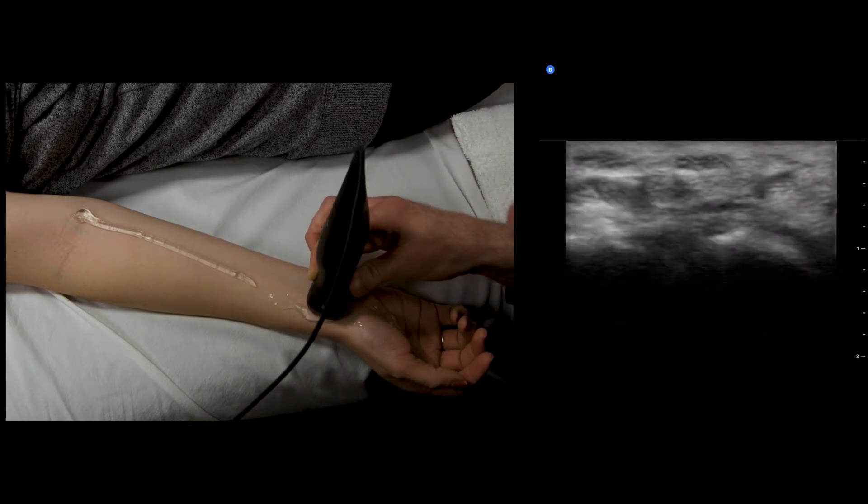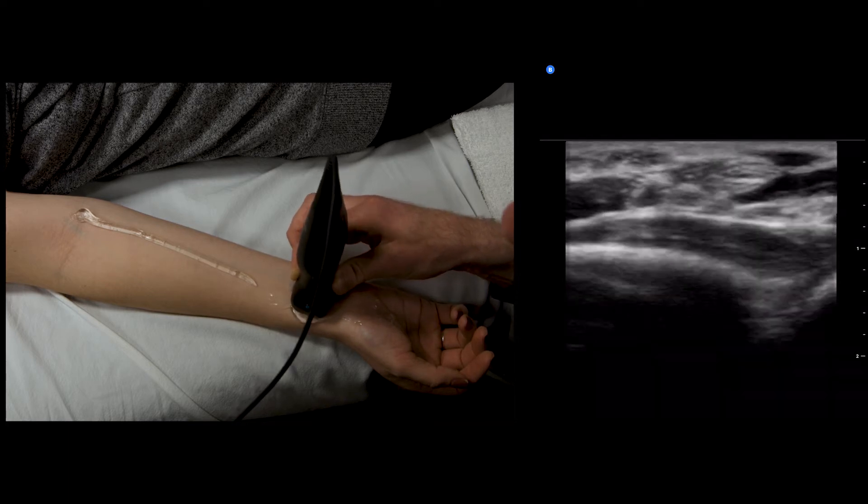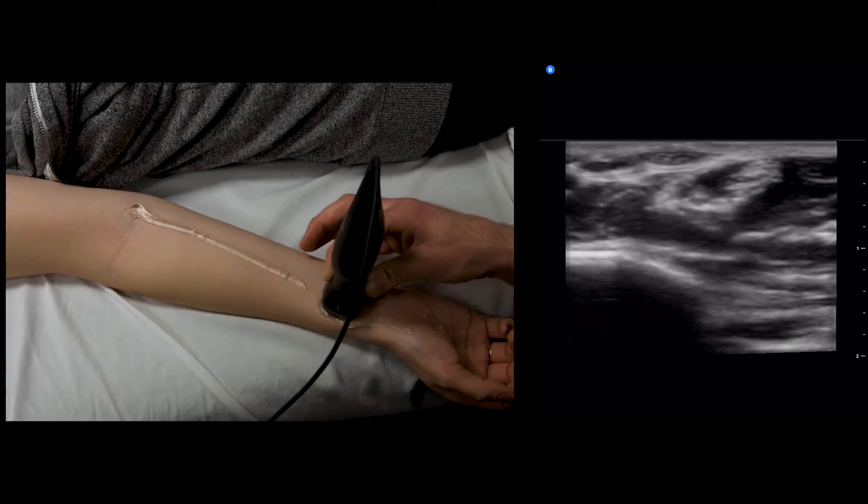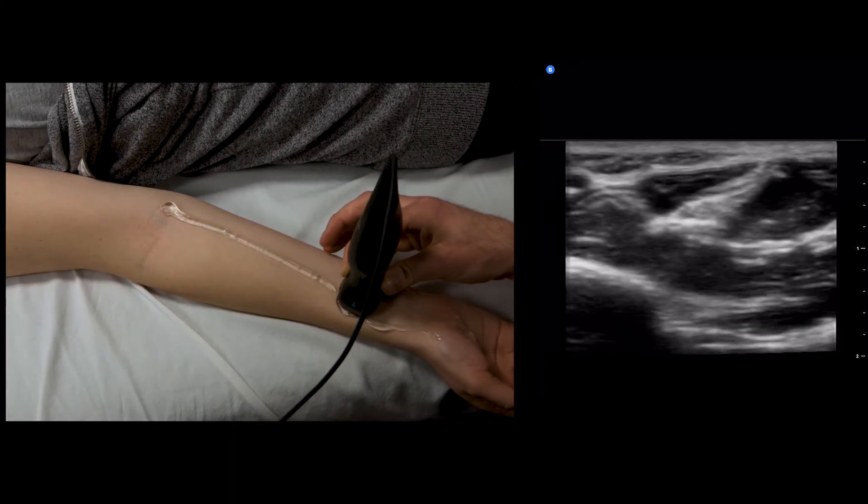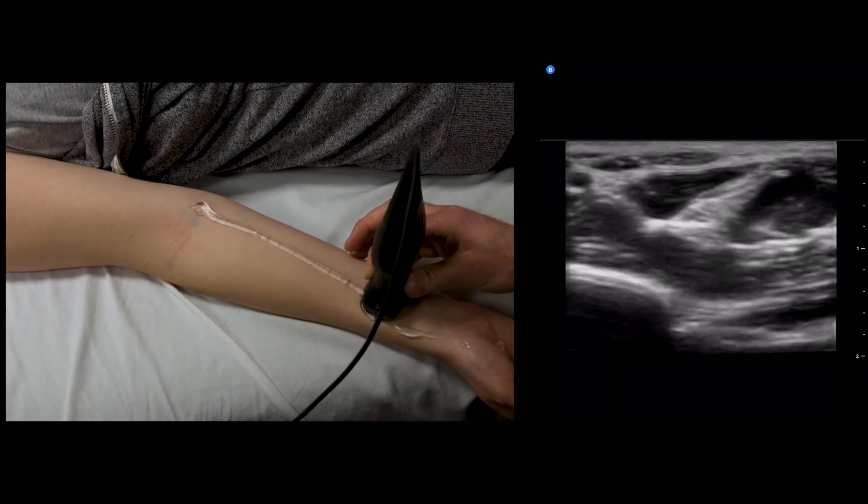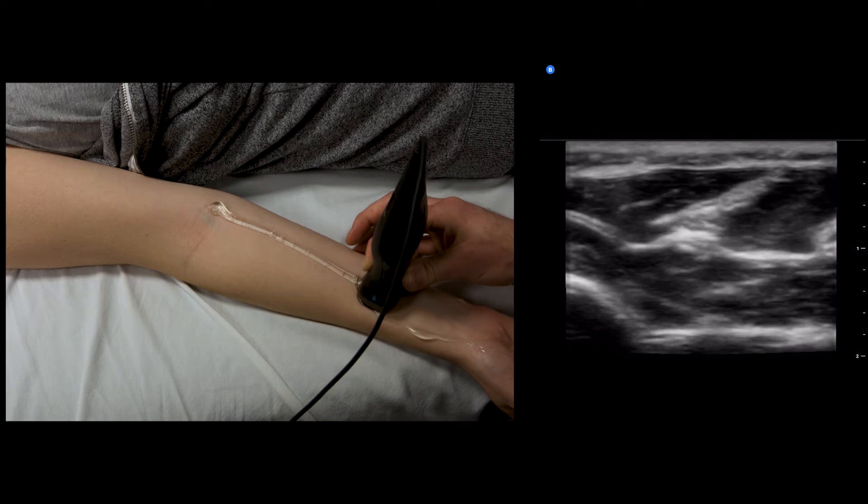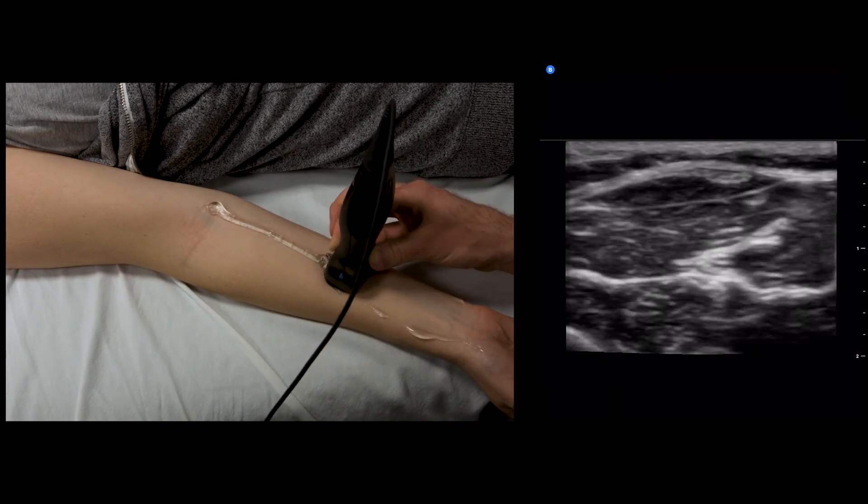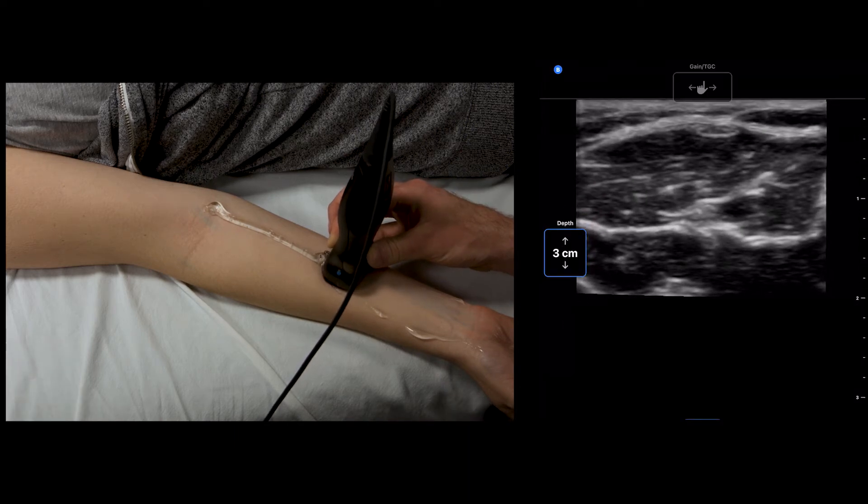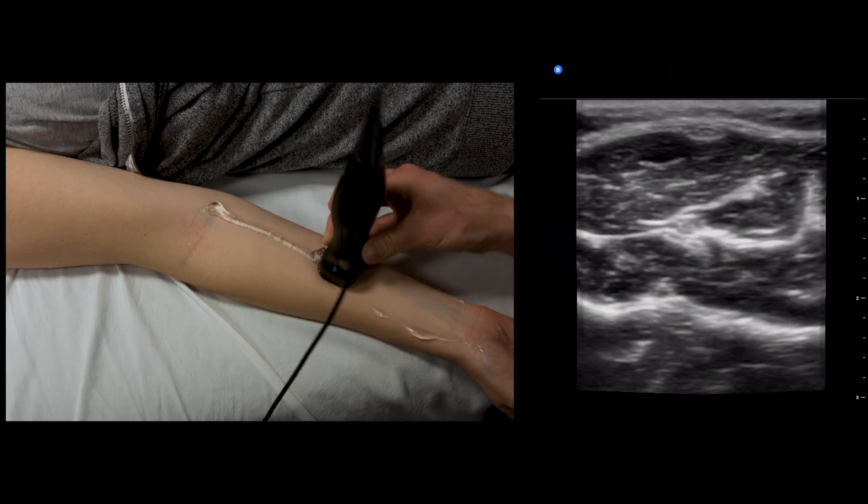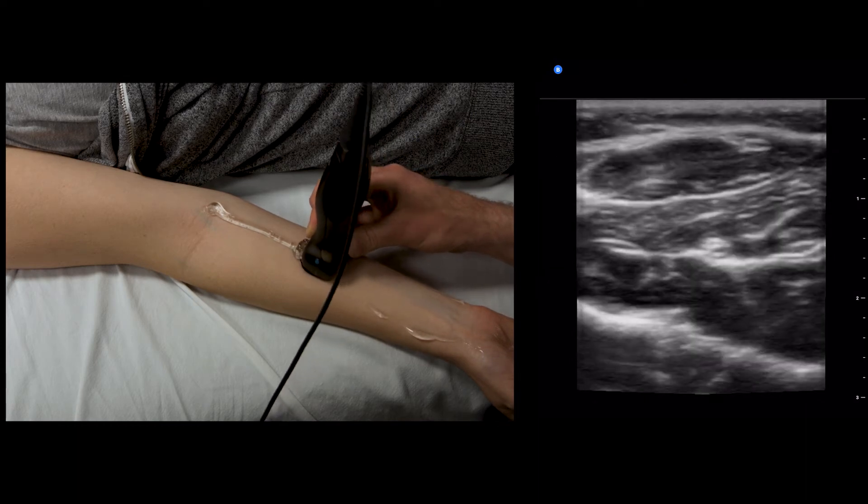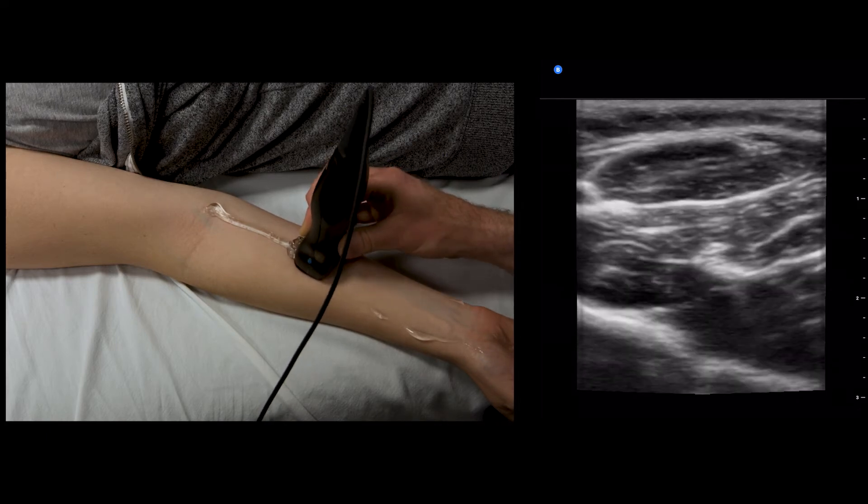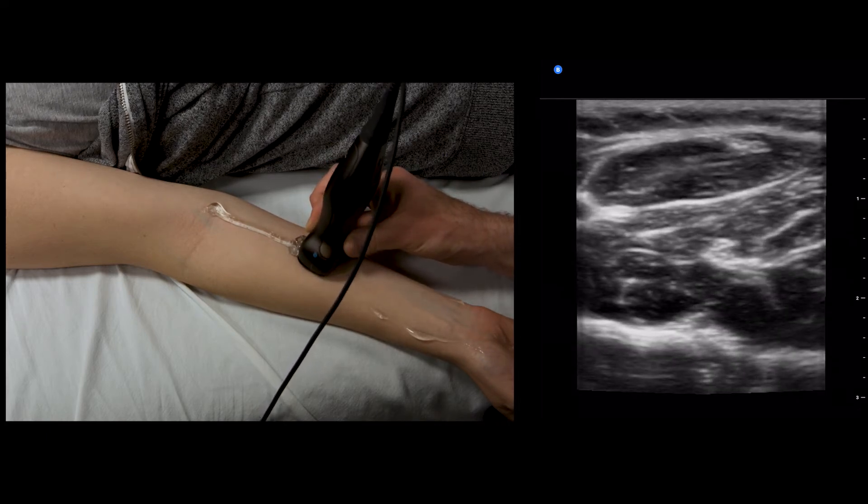Then we're going to follow the median nerve proximal. It's going to go radial, drop just deep to flexor carpi radialis, go underneath the flexor pollicis muscle belly, and then move medial to lie between the deep and superficial compartments. The median nerve is lying between the deep and superficial compartments. Just deep to the median nerve, you can see a pulsating structure.